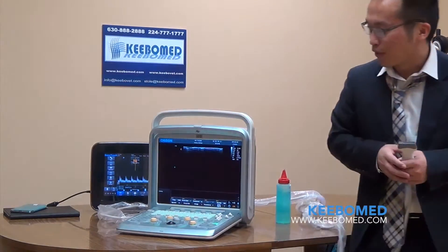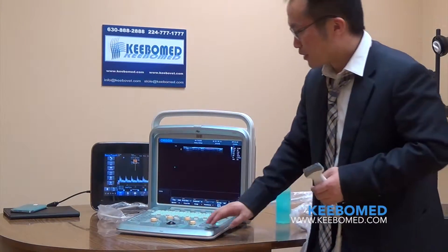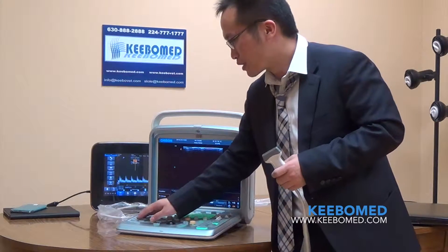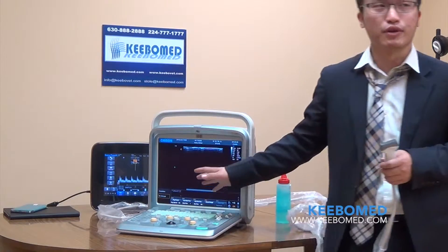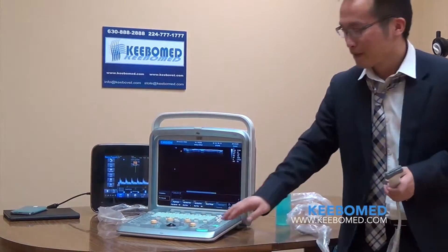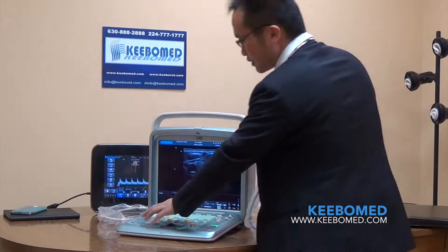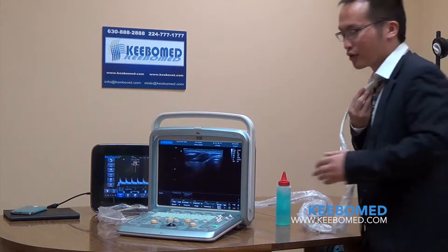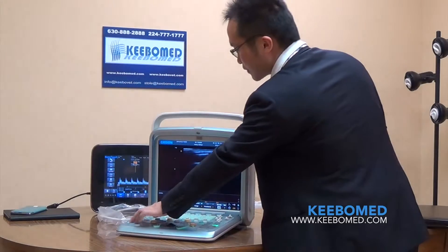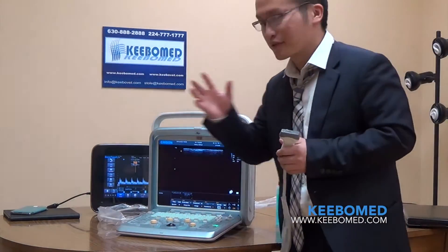For our system, we have another function called One Key Save. When you freeze the image, you can press this button to save images or save to the same memory. Most companies can do this, but for our system, we can also save the image in real time — you don't need to freeze first. Press it now and you can save the image or save to memory, even while it's running in real time.